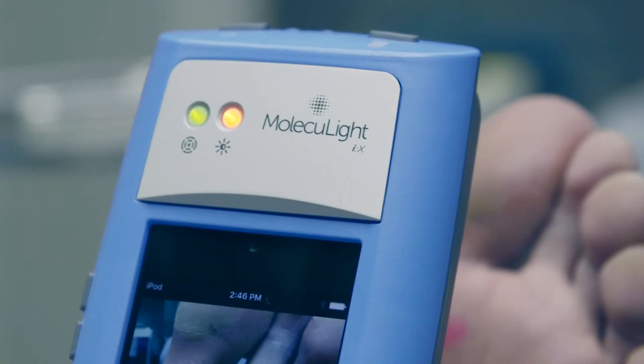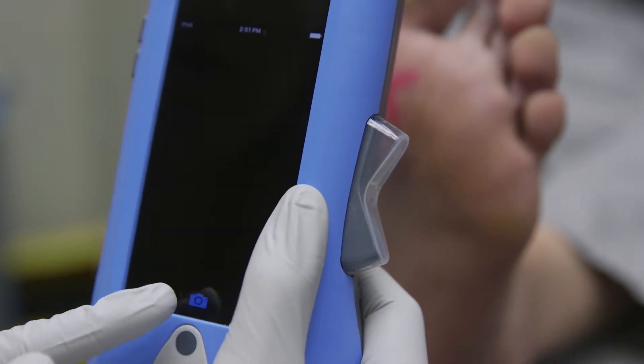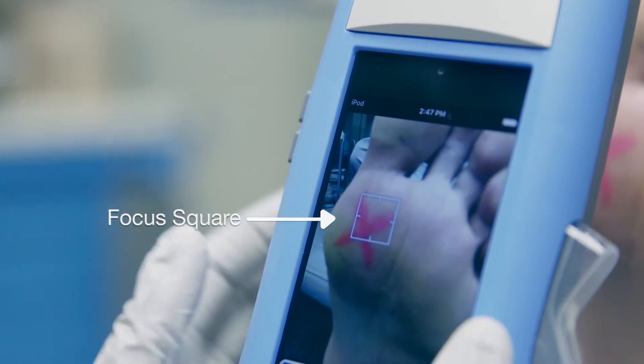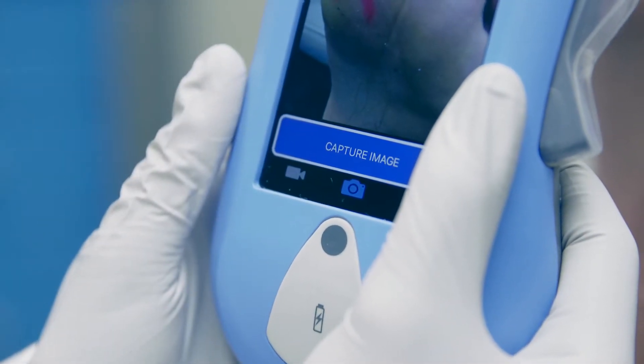During standard imaging mode, the ambient light sensor will be amber. Select the camera icon to capture an image. You can improve the autofocus by manually tapping the screen on the exact area you want in focus, and a focus square will appear. Press the capture image button for a still photograph.